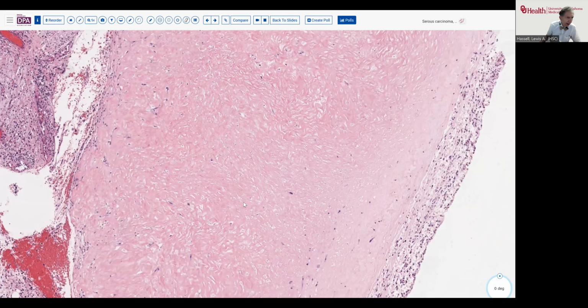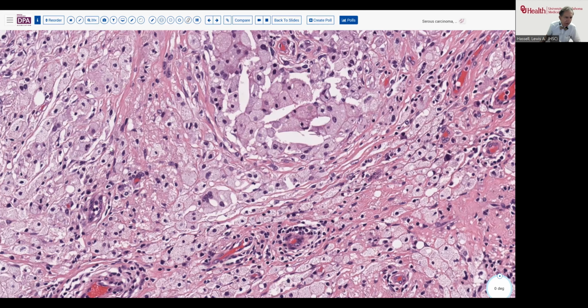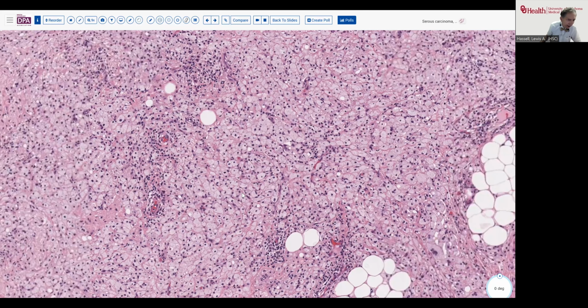And then deep to it, we have this very florid histiocytic response, plus or minus maybe some cholesterol clefts, a few giant cells and so forth, with admixed lymphocytes. So this is quite clearly a response in this area. But then we want to be sure that we are not missing a few things. So looking at things that look different, these dark cells, and scanning over the slide a little bit further will allow us to look at some of the other kinds of areas where, maybe the cellularity gets a little bit higher, more lymphocytes or something, and that doesn't look particularly concerning.